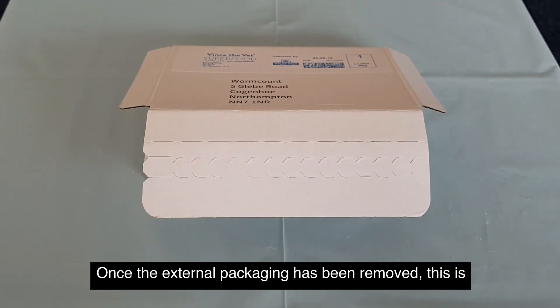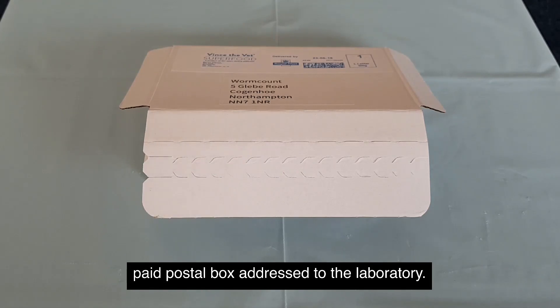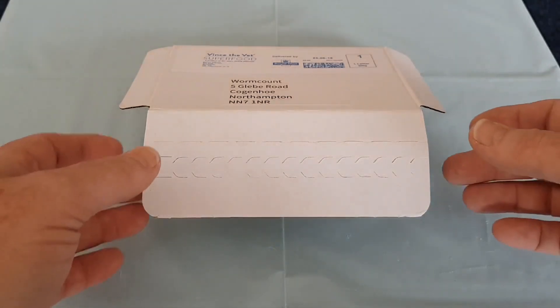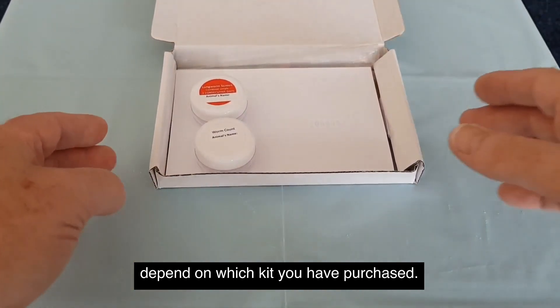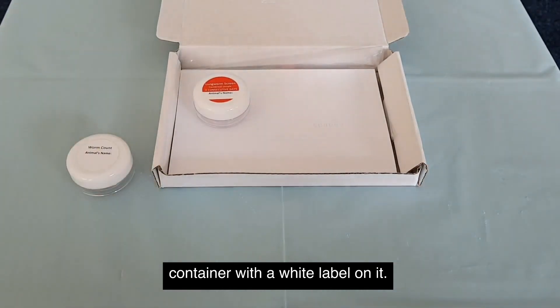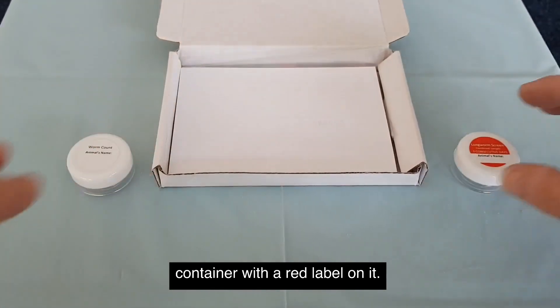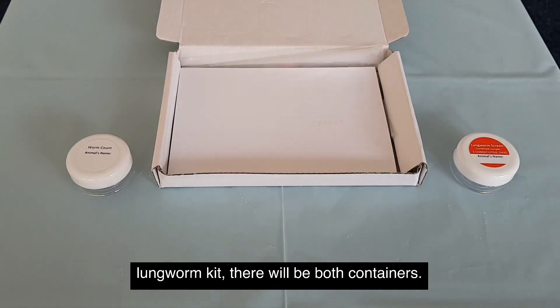Once the external packaging has been removed, this is what you will find: a return paid postal box addressed to the laboratory. The first thing to do is to unpack the contents. What you will find will depend on which kit you have purchased. If you have a worm count kit, there will be a single container with a white label on it. If you have a lungworm kit, there will be a single container with a red label on it. And if you have bought the combined worm count and lungworm kit, there will be both containers.